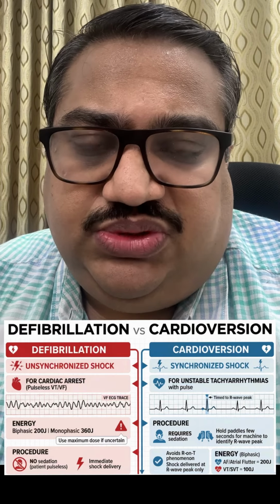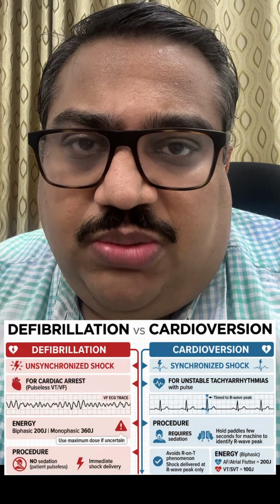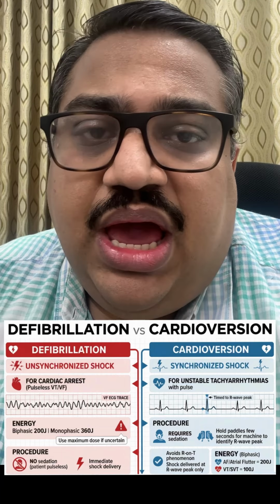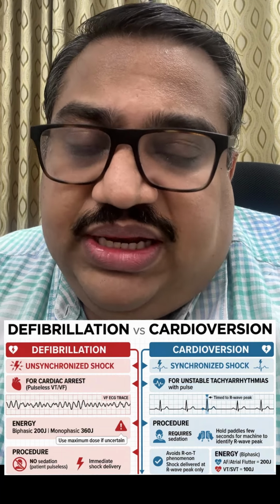So defibrillation is the procedure by which we try to revert the two shockable rhythms, pulseless ventricular tachycardia and ventricular fibrillation. It is always not synchronized, and we use a higher amount of energy. So that is simple defibrillation. Let's see what cardioversion is.